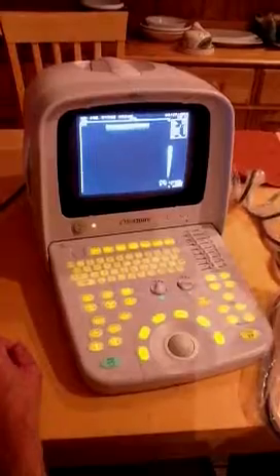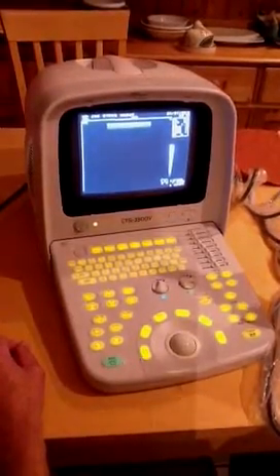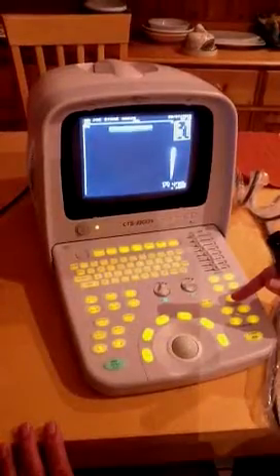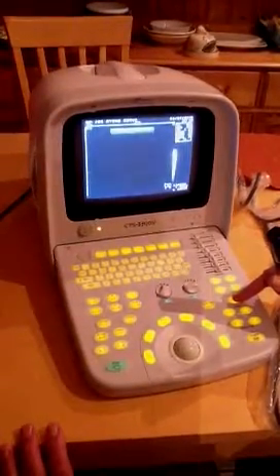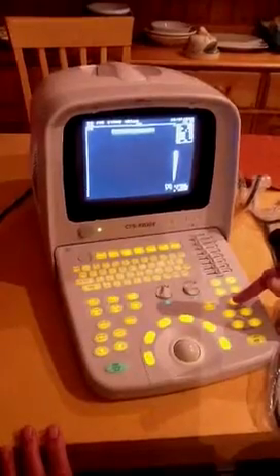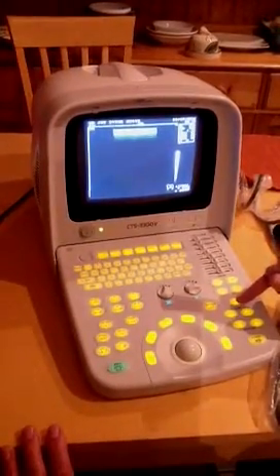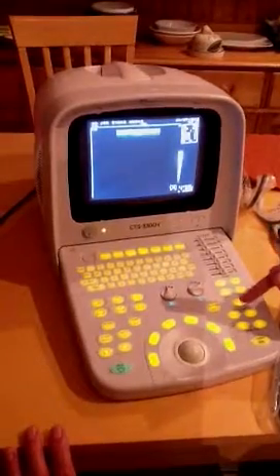The way to vary the frequency of the probe is just by pressing the frequency button here on the keyboard. It's at 7.5 at the moment, so you just press the button — that goes up to 8.5, then 10 MHz, and it'll back down to 5 MHz. So it's a toggle switch.